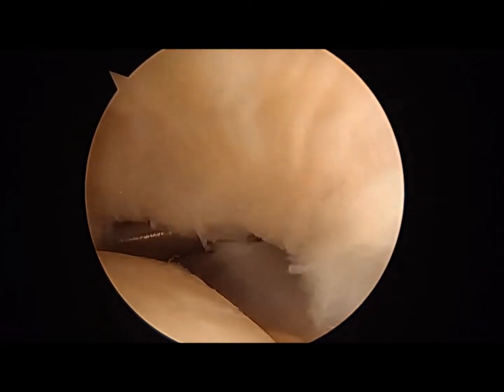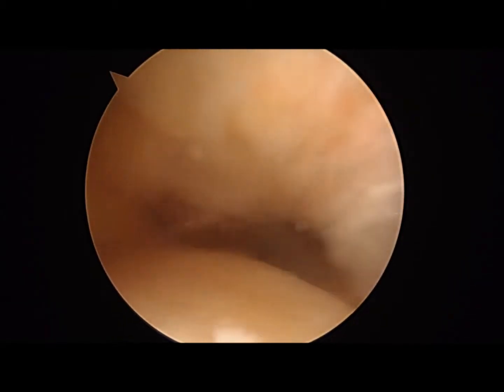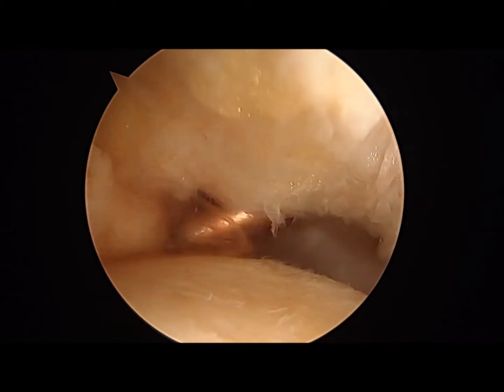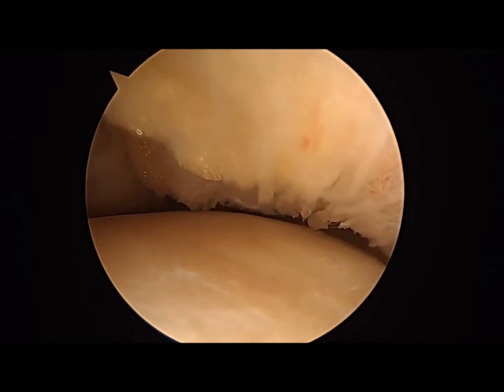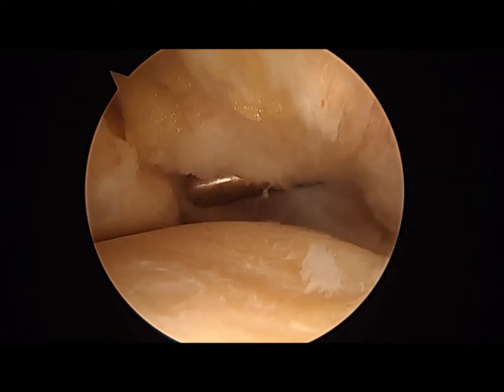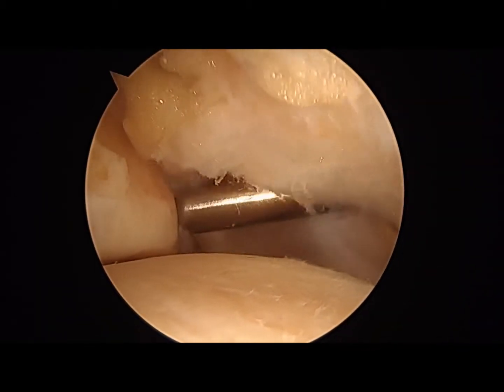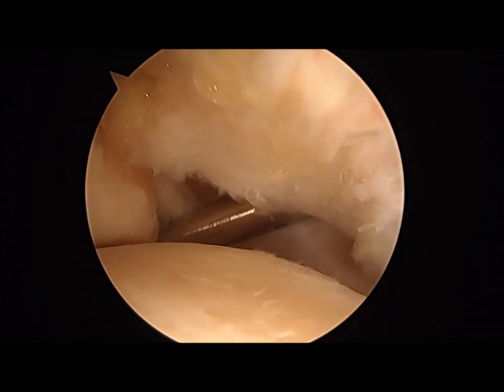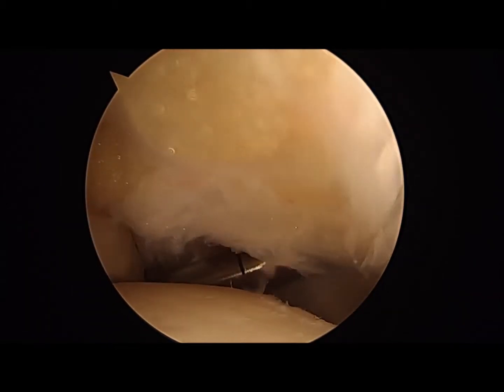This is the anterolateral gutter. I'm going in right now, going after the anterolateral space. Keep bringing up any meniscoid loose body in there. Going in the fibula. That's the syndesmosis we're looking at. Go in there, go in the gutter.